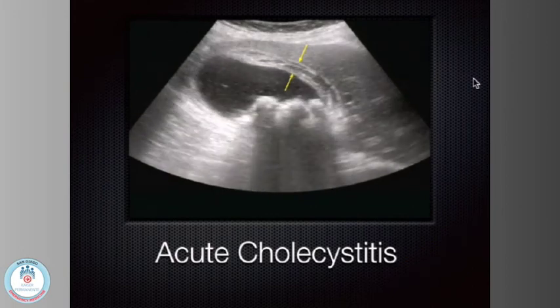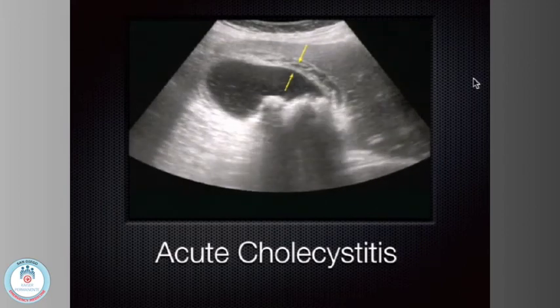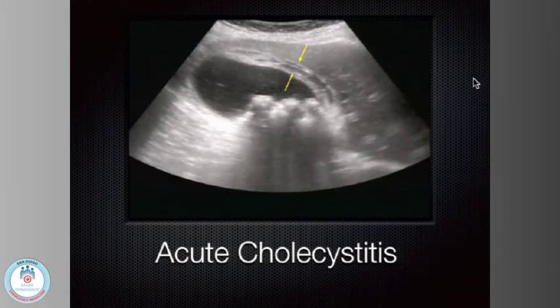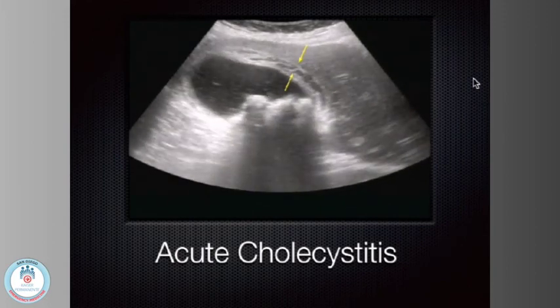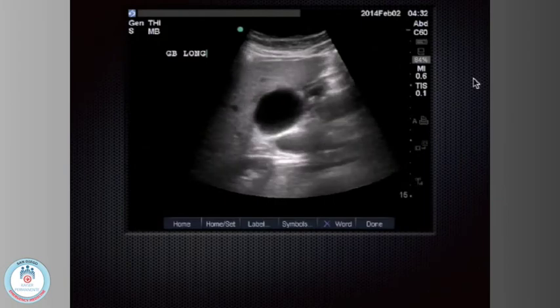This is a diagnosis you can make very easily. Slap the probe on, you know exactly where the patient's going. It explains their 22,000 white count. You're hanging antibiotics, and you put the whole thing together in less than 5 minutes. Emphysematous cholecystitis would be air somewhere, and air in the wall of the gallbladder causes the sound to get scattered everywhere. You might even see comet tails, but fluid looks like this hypoechoic stuff up there.